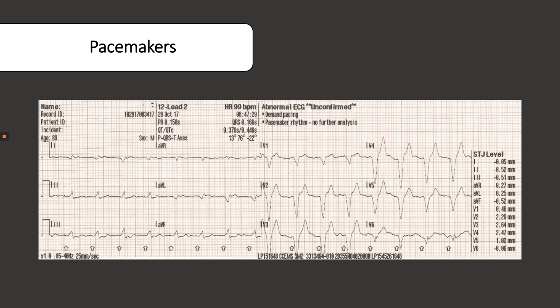Way back when, they used to say that putting a 12 lead on somebody with a pacemaker was useless. That is kind of gone out the window a little bit, in a video that we'll talk about later as to why. There's still a lot of information you can extrapolate from a 12 lead with somebody with a pacemaker.